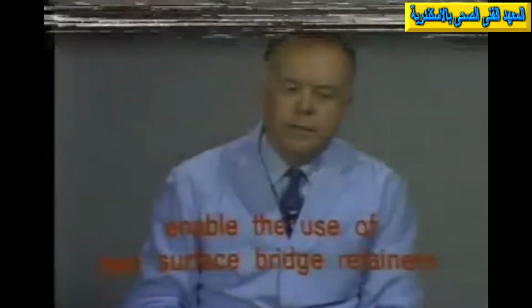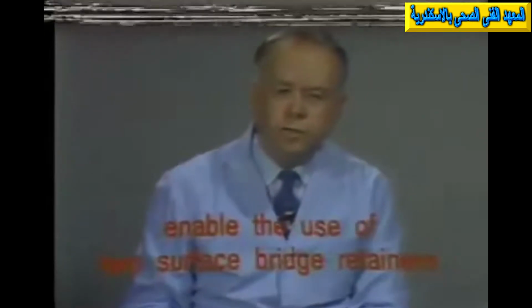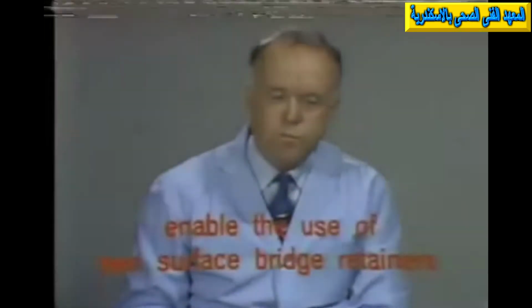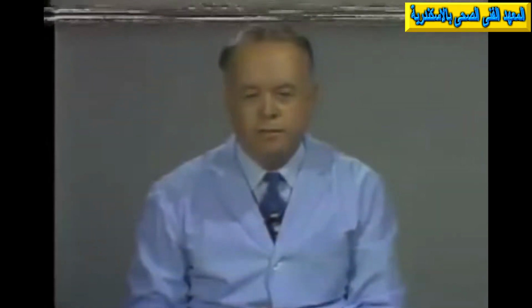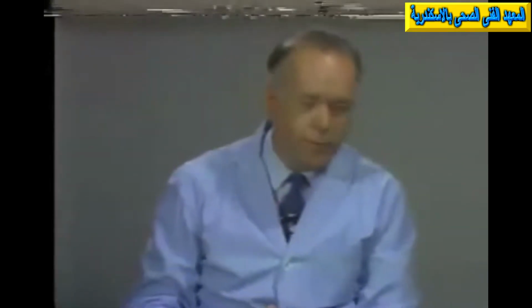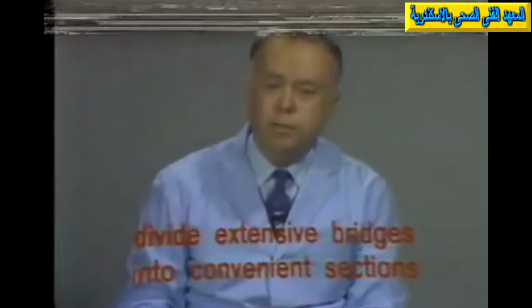The semi-rigid connector enables you to make an adjustment in this relationship and place bridges in situations that otherwise might be difficult. The second use that we want to talk about is in the use of the semi-rigid connector in the use of just 2 surface retainers, more simple retainers, which would not have sufficient retention if they were attached to a bridge rigidly. But by interposing a semi-rigid connector, it's possible to use these smaller, less retentive retainers in certain situations where they have definite advantages.